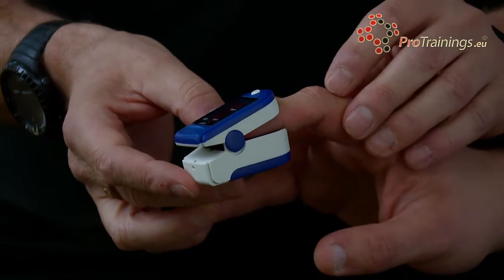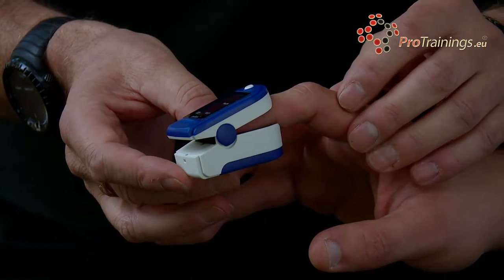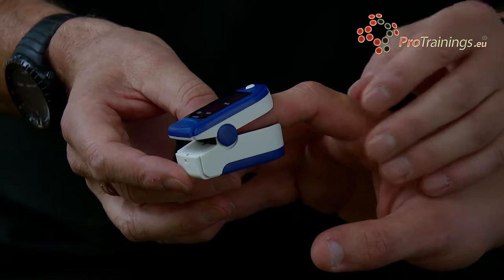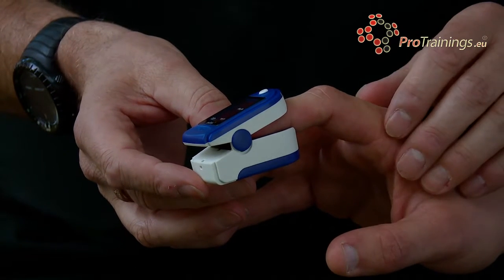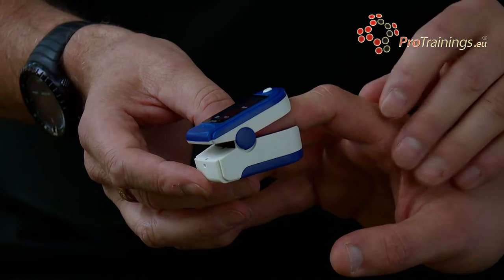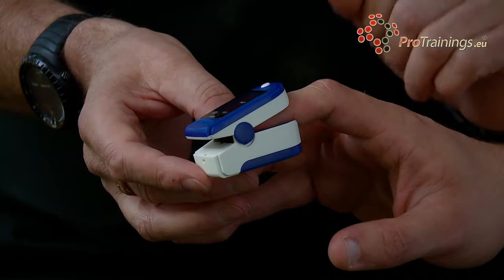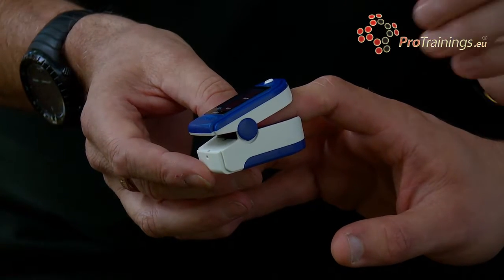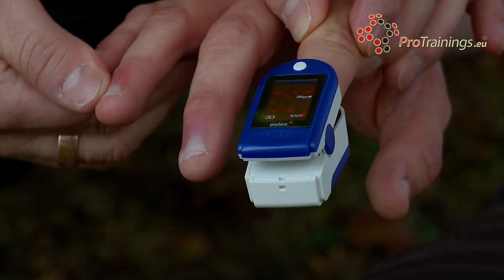We're looking for an oxygen saturation between 95 and 98%. If that's the case, this patient doesn't require oxygen. They're breathing quite happily, their airways are working fine, oxygen is getting to the tips of the finger and giving us an accurate reading. If it drops below 95, we are now talking about a hypoxic patient that does need some oxygen to help them breathe.